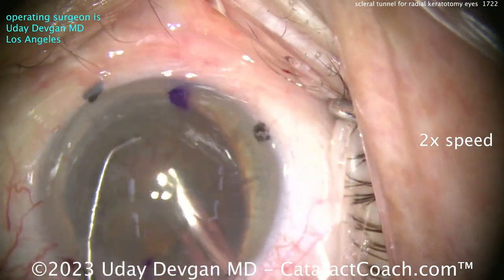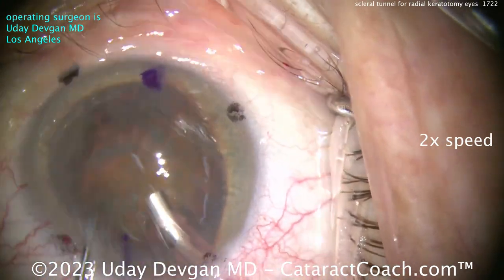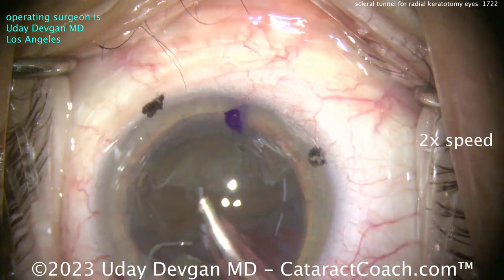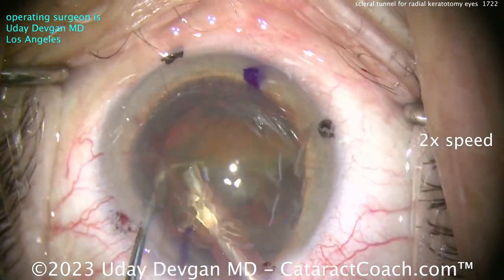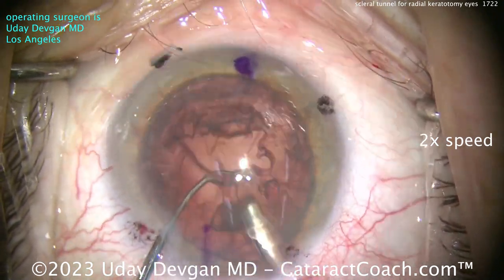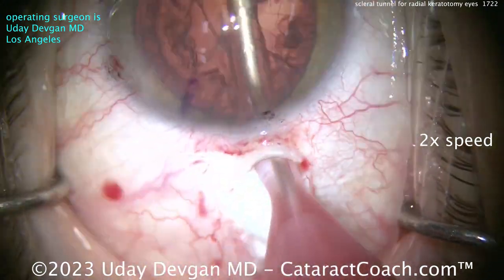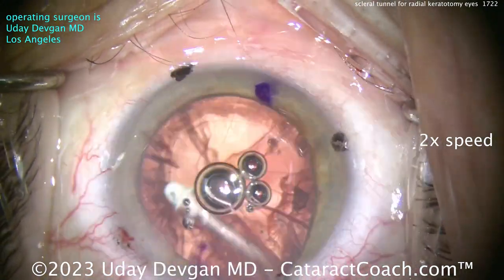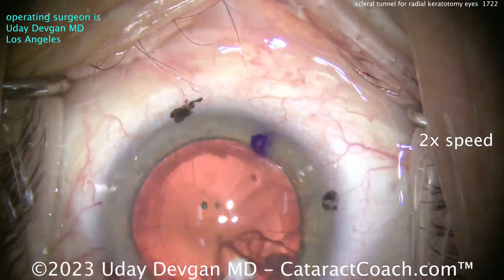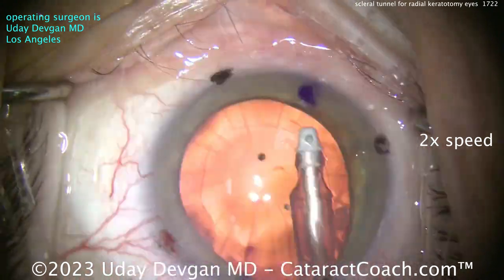There's the nucleus out of the capsule bag — partially. Just chop and emulsify it down. Again, this is not the hard part of the surgery. Be careful, though — during this part I tend to use a lower infusion pressure; I don't want to put too much stress on those RK cuts. We also want to be very cautious not to inadvertently rupture the posterior capsule. With the I&A probe in the eye you can really see, with a good red reflex, all those RK cuts — there are really a lot of them in this patient.